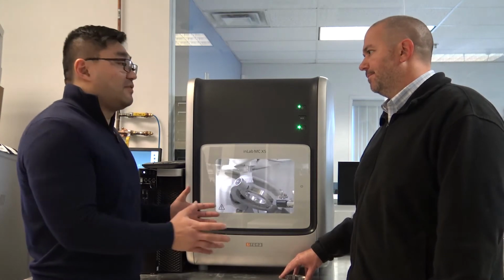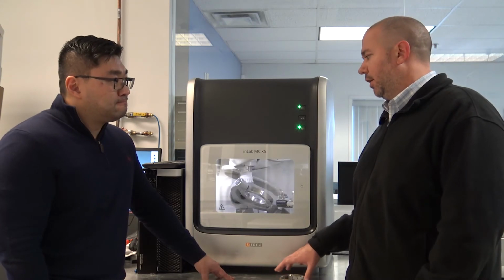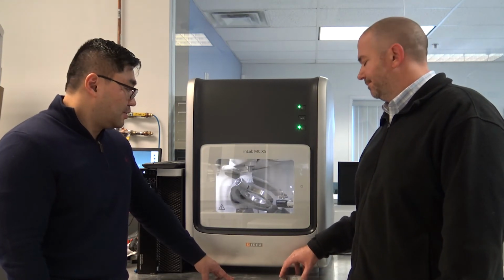So being a 5-axis mill, I imagine you've probably done some screw-retained crowns or all-on-4s. Any problems or troubles milling those types of more complex cases? No, I mean it can go up to, I believe, 30 degrees in angle. Insertion angles? Insertion angles. So really, the software will let you know when you're designing or in the CAM software. It'll show you the areas that are not going to mill out or might have issues, but really it can mill almost anything. Great.